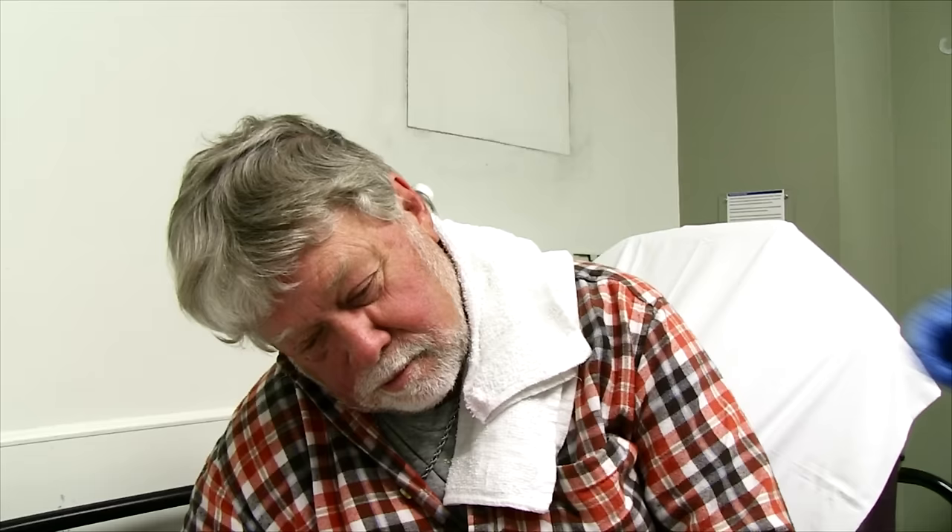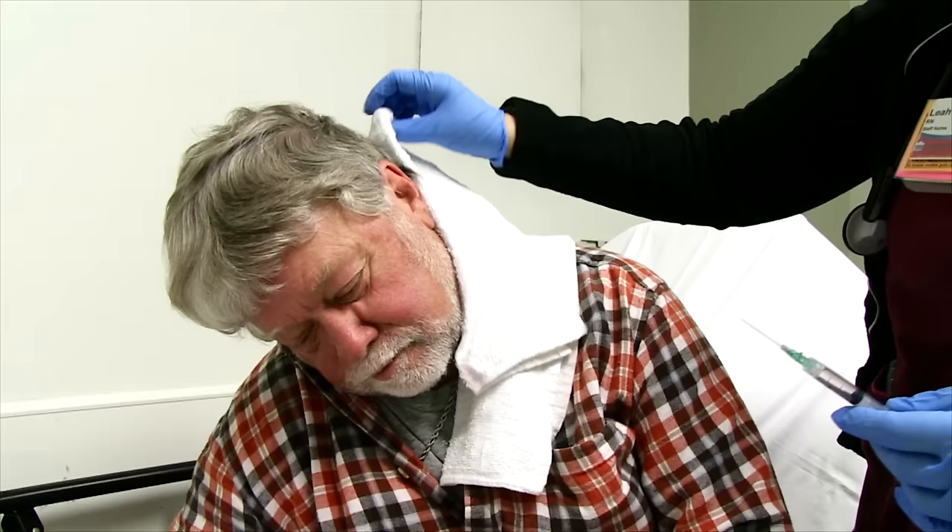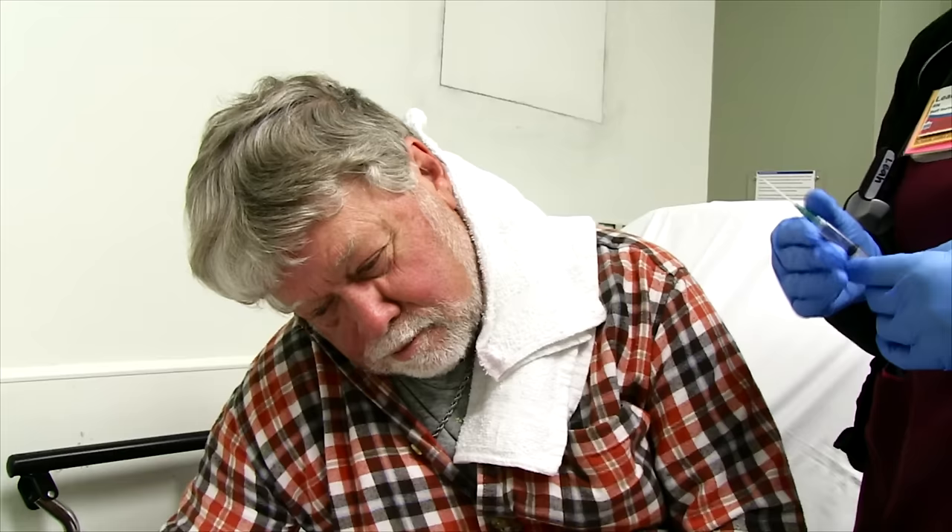What did you do first of all, Leah? So I put a couple of drops of Colace in his ear. We waited about 15 minutes before we actually came back. He stayed lying down during that time, with his head tilted so the Colace would stay in.